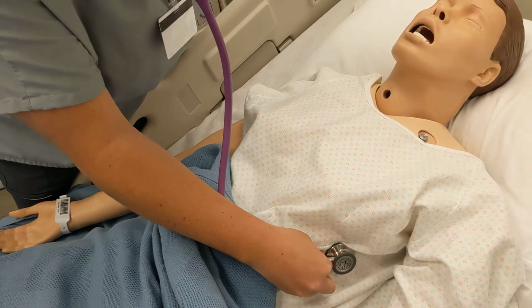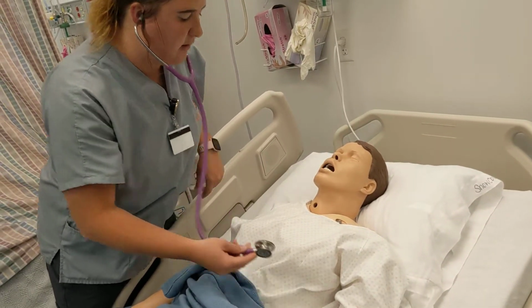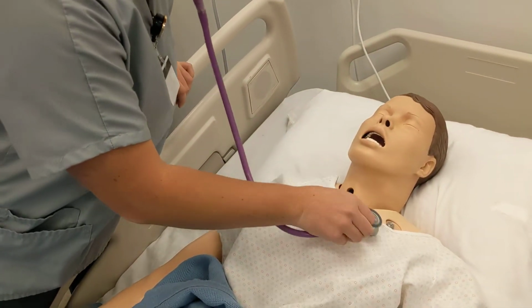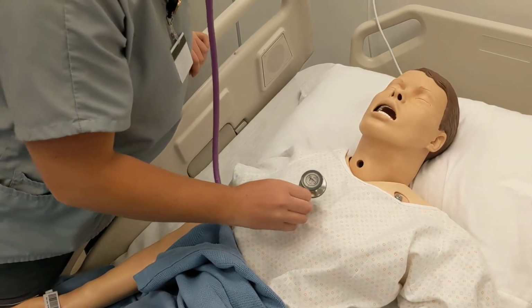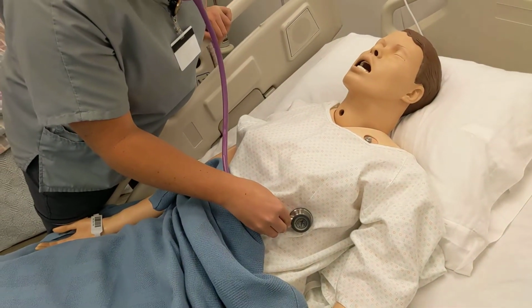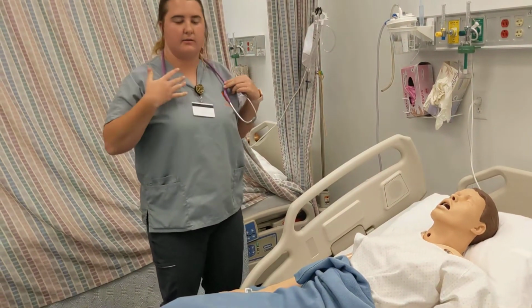I'm going to assess the rate and rhythm for a full minute if this was a real patient. Okay, and now I'm going to listen to her heart. I'm going to listen to the aortic point, the pulmonic point, Erb's point, the tricuspid point, and the mitral point. Okay, everything sounds really great. Her rate and rhythm sound good. I can hear it really well.